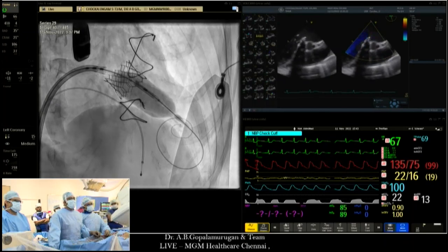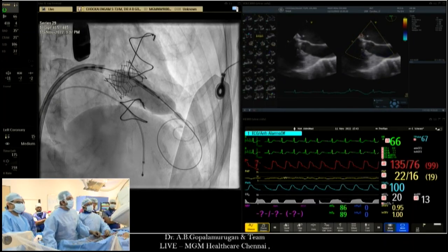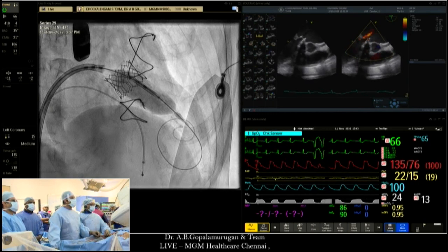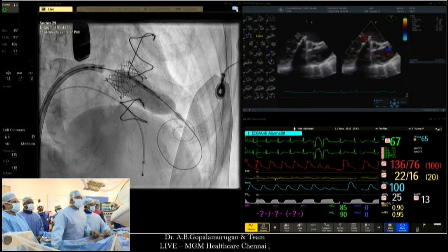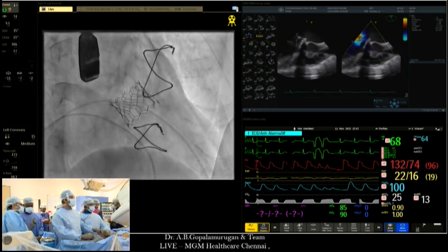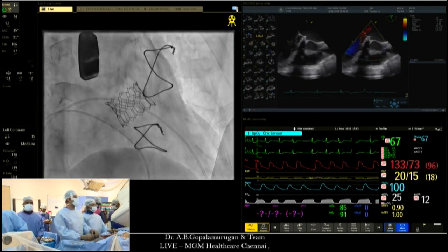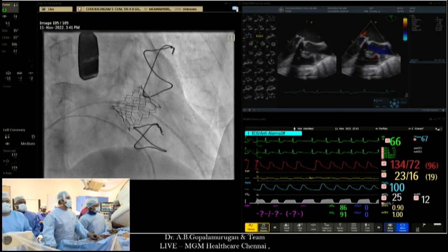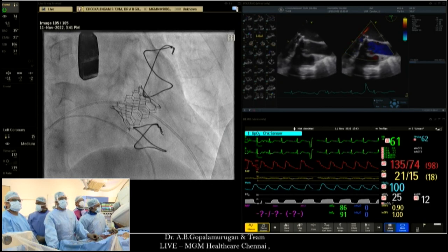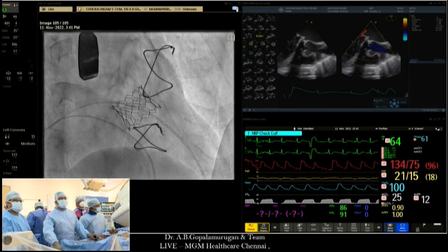Complete embolization, partial embolization towards LA, towards LV, those are all important. Obviously, myself and Gopi, we had partial embolization. So immediately you load one more valve, you go in and put it. In the end, you see the TE pictures, you will see nicely two valves opening, valve in valve. But it's a fantastic demonstration of how you have to do it. Because you started with that 50%, it will try to dive in. But once you inflate it, you can see it's pushing towards the roof. The implantation, as you push the catheter, it makes contact.